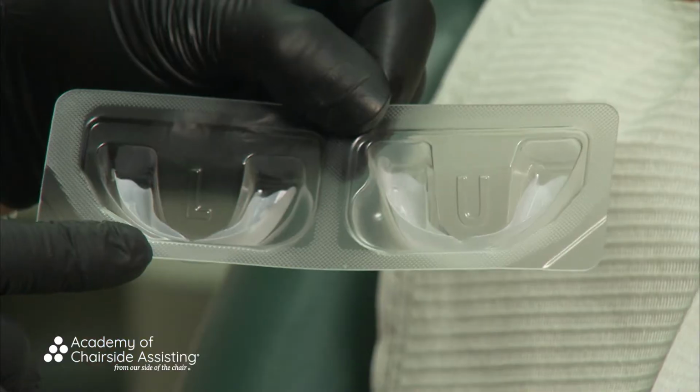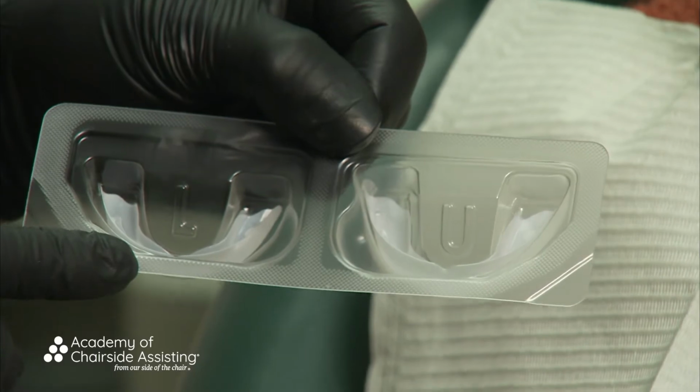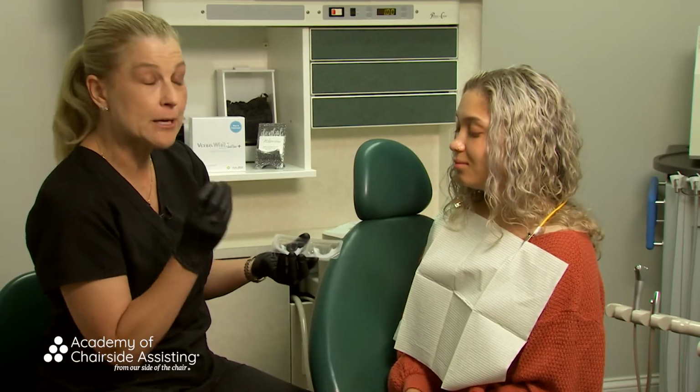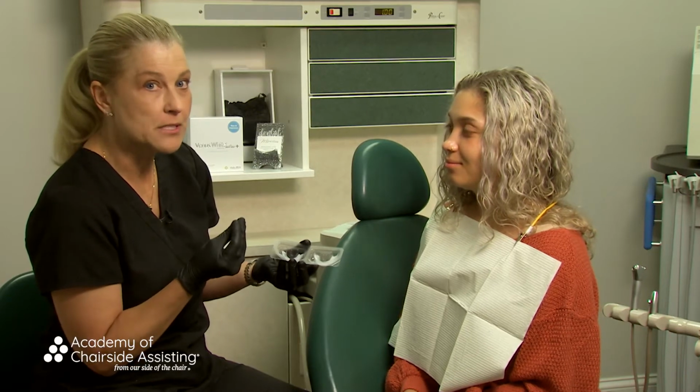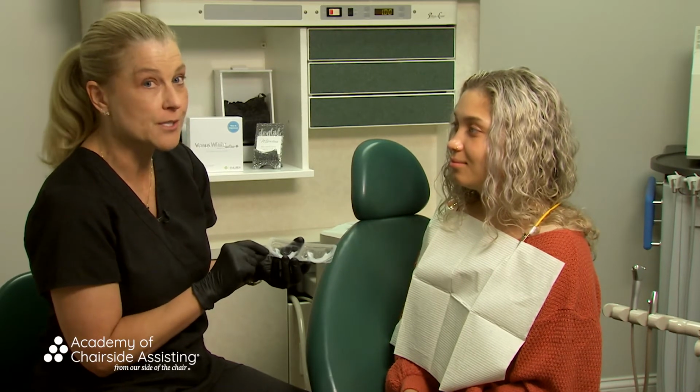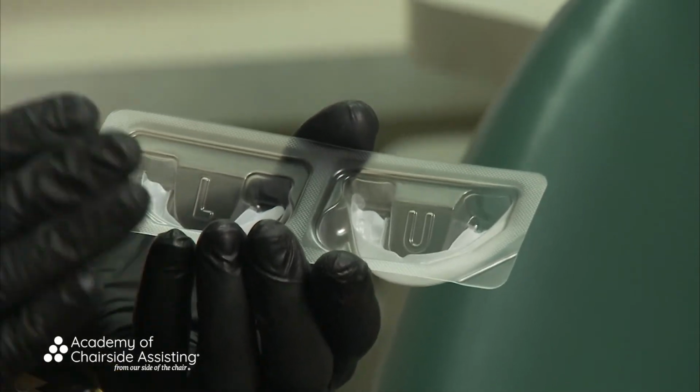Another thing I want to showcase is how much bleach is in this tray. If the patient puts this on their teeth and pinches it too hard, they can actually push the bleach onto the gums. And remember, this is a hydrogen peroxide. It's very strong and it can irritate and even burn the gum tissue. So we want to be really careful.